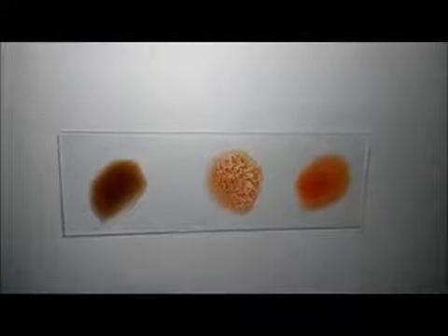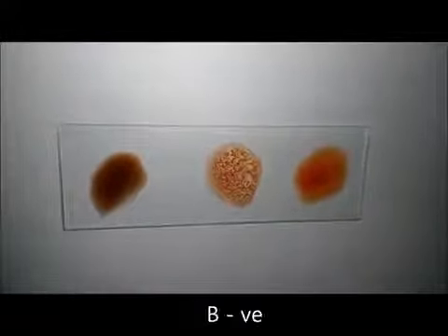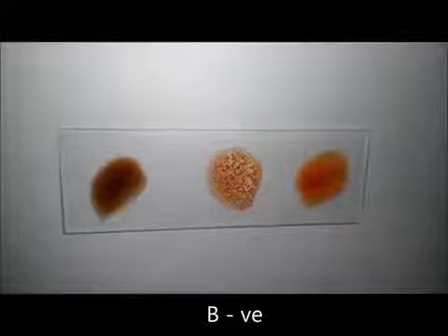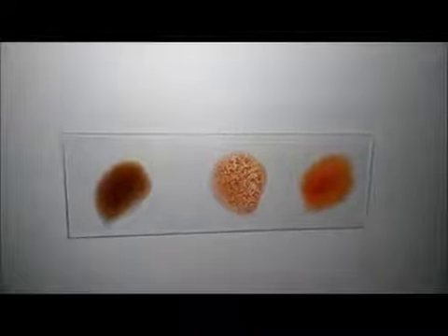As you can see in the center, this is how B negative looks like.